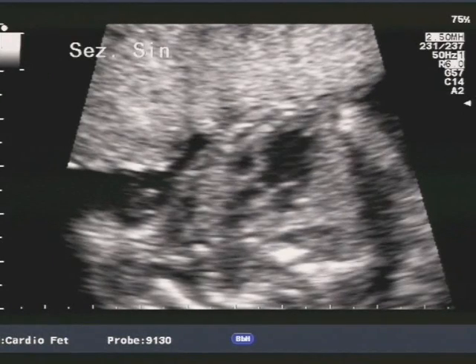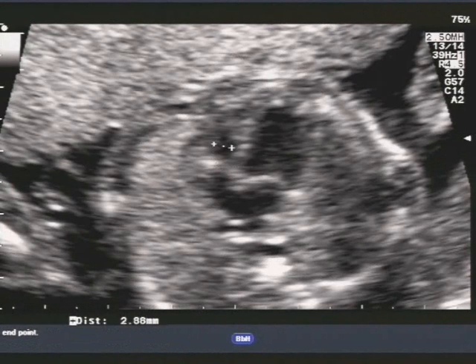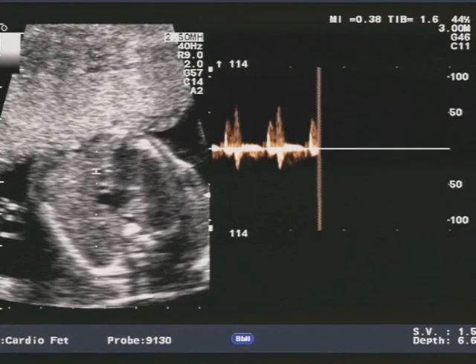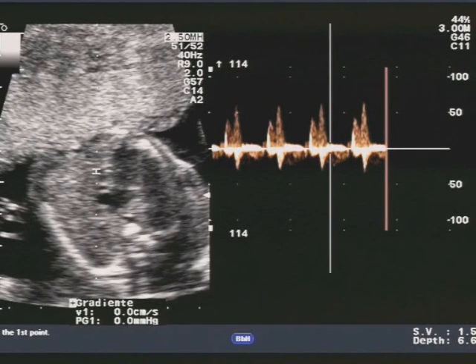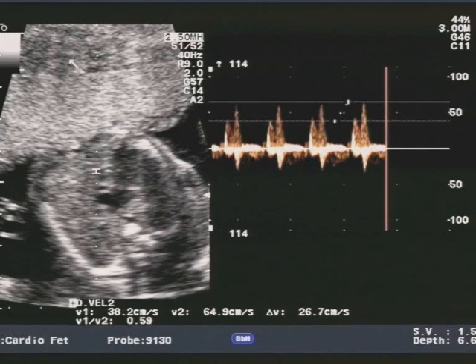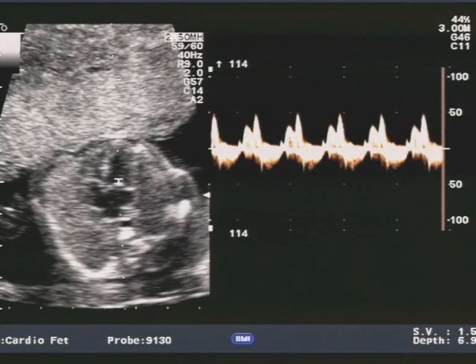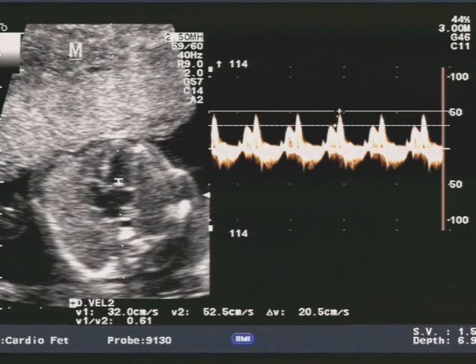Gentili colleghi, vi mostro adesso un caso che, a mio giudizio, presenta alcune caratteristiche molto interessanti. Si tratta di un cuore destro ipoplasico nel quale si noterà la presenza di una riduzione biometrica del ventricolo destro e ancora di più dell'arteria polmonare, ma la cui classificazione risulterà poi alla fine meno semplice di quello che può sembrare.